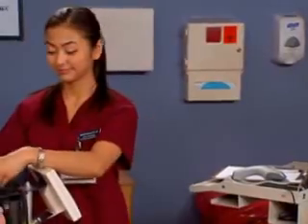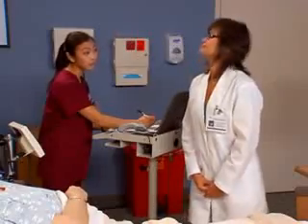Wow. Glad it's not high. Don't worry, if it was abnormal, Rose would know what to do. Report it to the primary care provider immediately.